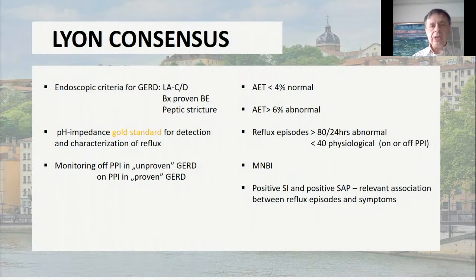Dakle, ako je poprilično jasna stvar, a radi se o čistom dokazivanju i isključivanju nekih drugih stanja, s obzirom na financijsku situaciju koristim pH-metrijski kateter sa 2 odvoda, standardni. Za sve ostalo gdje je potrebno, ili ponovim nakon toga ako mi nešto nije jasno, sa impedanca kateterom, ili kod stanja gdje bi se moglo očekivati motorički poremećaj, o čemu smo i malo prije slušali, eventualno sumnja na hipertenzivni jednjak ili u sklopu dispepsije, onda svakako koristim impedanca kateter.